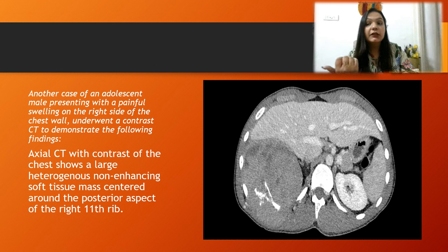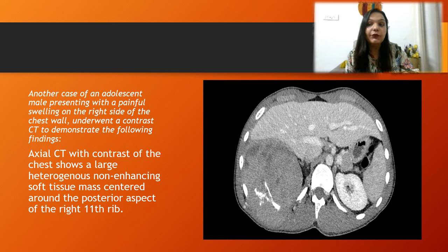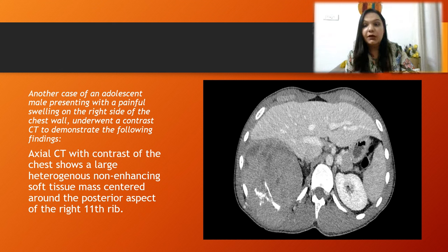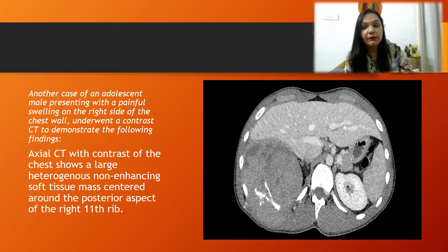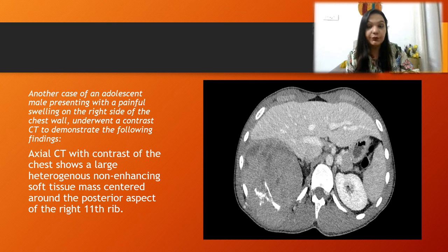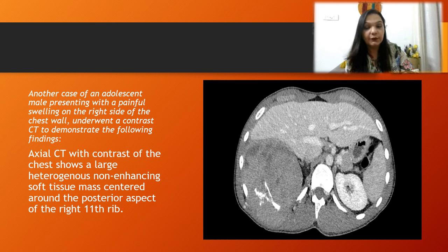Our second case is an adolescent male presenting with a painful swelling on the right side of the chest wall. CECT scan showed a large heterogeneous non-enhancing soft tissue mass centered around the posterior aspect of the right 11th rib, again with hypodense areas representing necrosis.